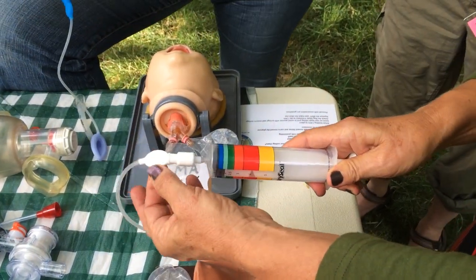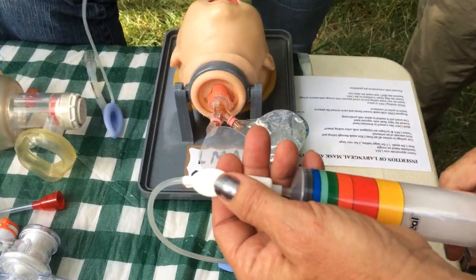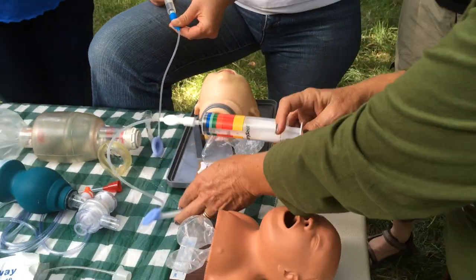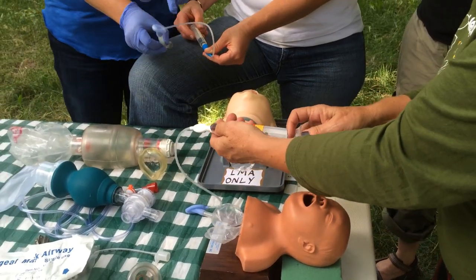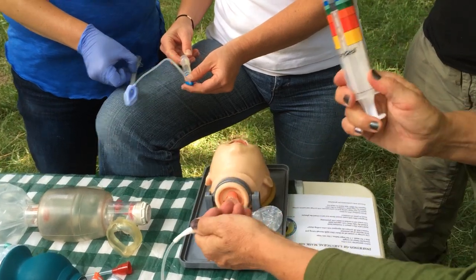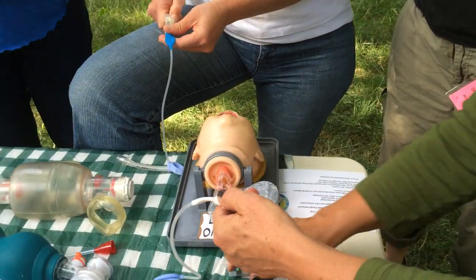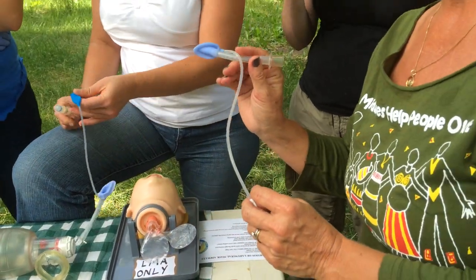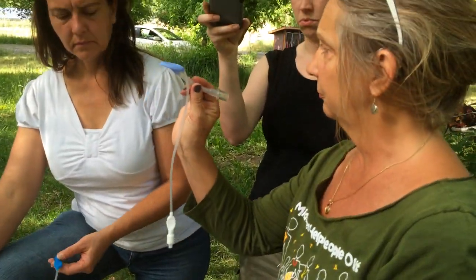You see what's happening to this? This is your indicator bulb. It's showing you what's going on in your mask when you have it inside of your baby and you can't see it, okay? So you want to take all the air out, and then you have to take the syringe off because otherwise it will self-fill, okay? So then you're going to hold that like a pencil.